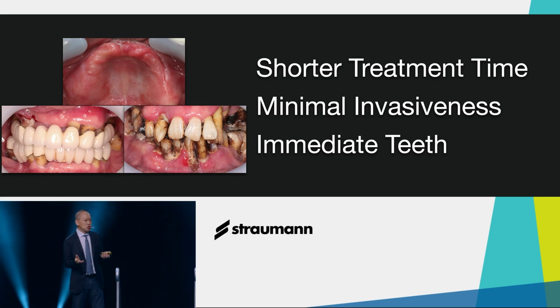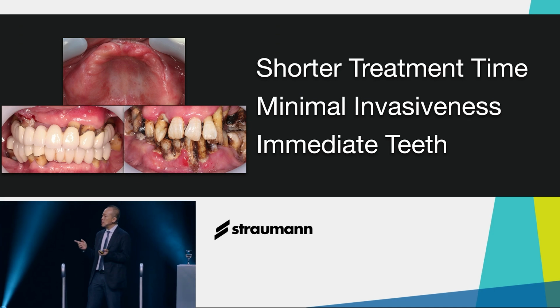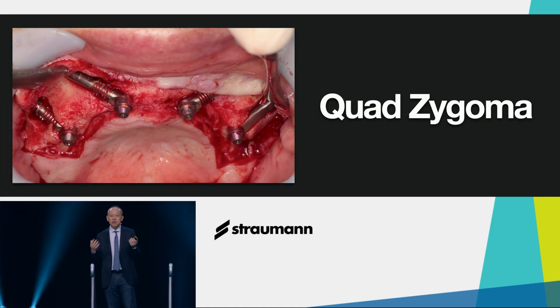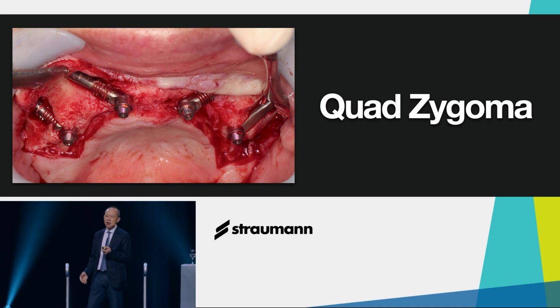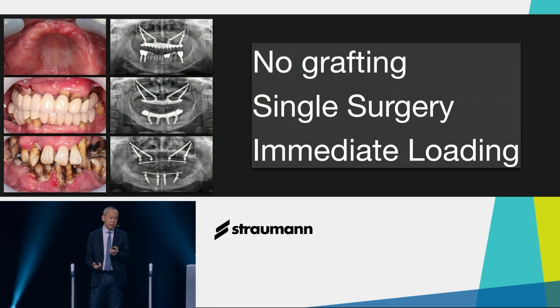So, no doubt, grafting and graftless solutions are both effective. However, if we take patient preference into consideration, shorter treatment time, minimal invasiveness, and immediate teeth are usually demanded by our patients. So, if you ask my opinion, nowadays, if I encounter a patient with severely atrophic maxilla, then quad zygoma is one of my main techniques to treat this group of patients.